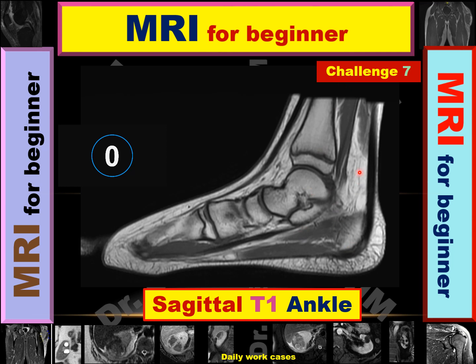Sagittal image, as we see in the ankle region, and T1 because subcutaneous fat in here and in the plantar aspect, in the back of the calcaneus and also tendon Achilles, and in the Kager fat bed, retrotalar here, all these fat appeared bright. However, the fluids in the articular cartilage appear dark, so this is T1. T1 ankle sagittal view.